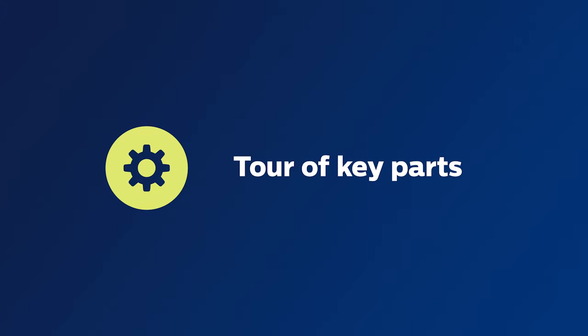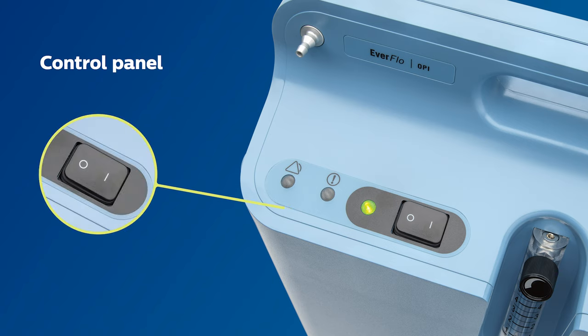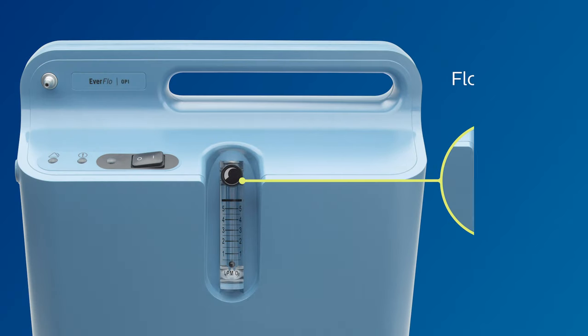First, let's take a quick tour of the important parts of your concentrator. The control panel can be found on the top left of the device. It consists of the on-off switch as well as lights that indicate the device is operating properly. To the right of the control panel, you will find the flow meter.